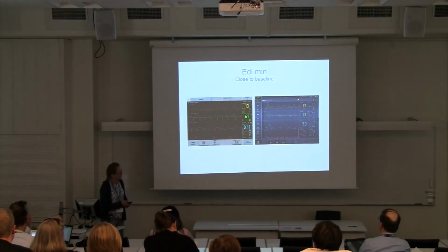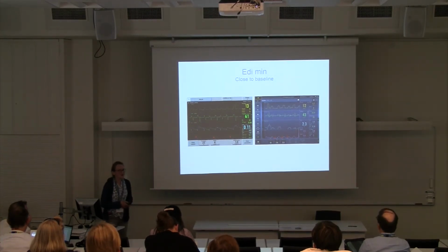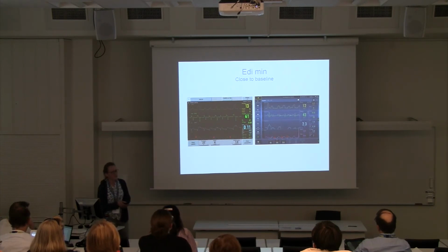And here are these 2 babies again. The EDI minimum value is close to 0, here 0.4, for both infants, as a sign that the diaphragm relaxes at end expiration. And so we thought that these settings, PEEP of 4 and 5, were good for these babies at this time.